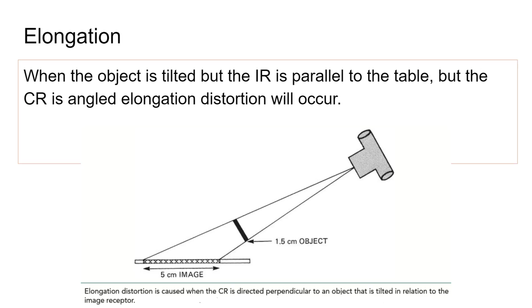Where we can't, right? We go with certain standard obliques at certain angles. So the radiologist will often see what they want, and also now it's very easy for them to take essentially a radiograph. You can switch from fluoro to a static image instantly by basically pressing a button.